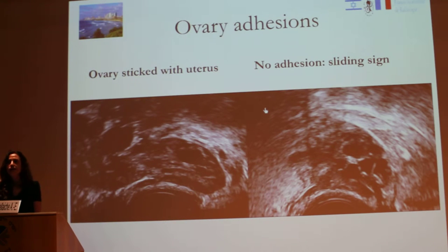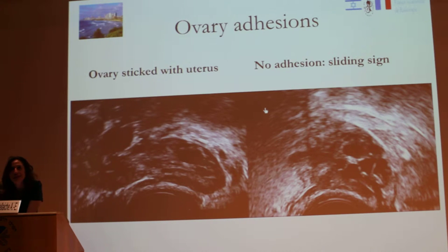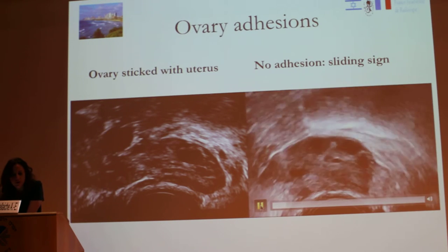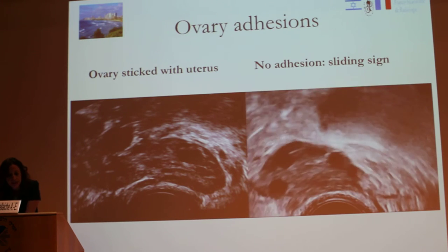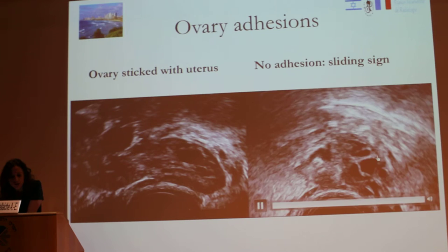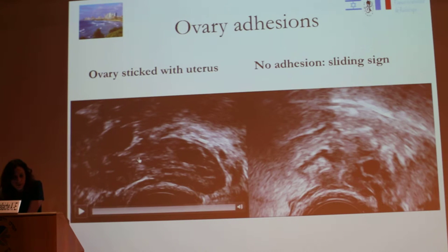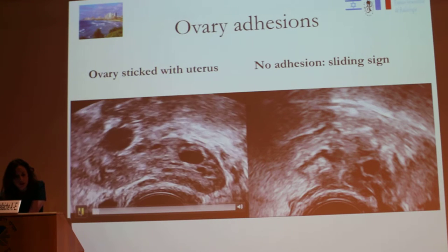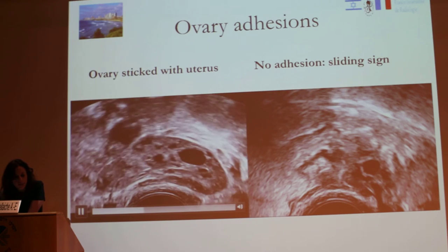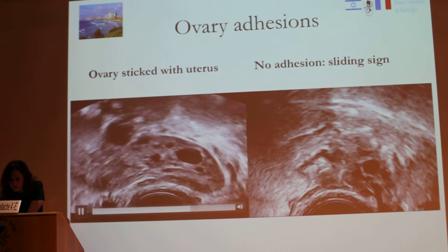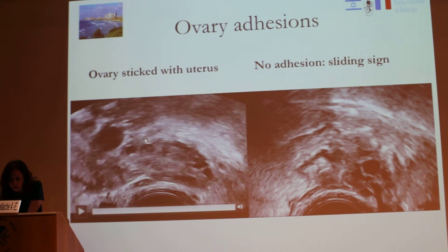Ovary adhesions are a very important element in infertility because they create dis-ovulation. Here you have a normal ovary. It is very important to apply compression — you can see that when you move the ovary there are no adhesions; everything is moving. When you have adhesions and you put the other hand and apply bimanual palpation, you have the ovary completely adherent to the uterus with no space between them.